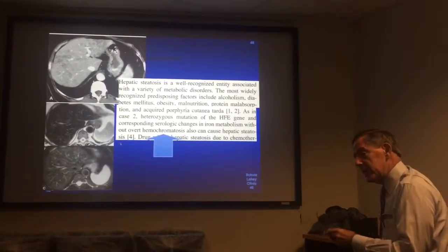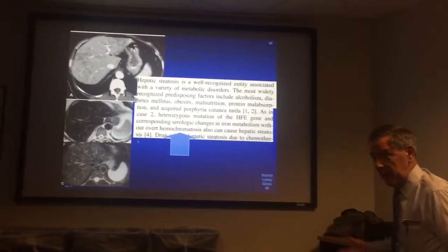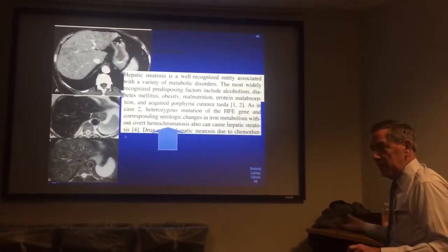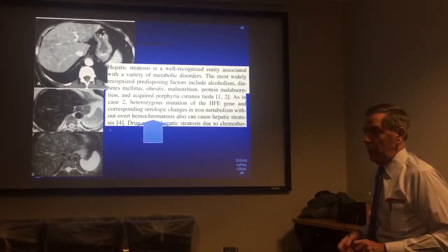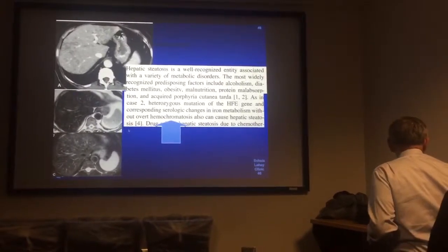Fair enough. And this is a case that some people would say as they're reading, I'll never see it. But I've seen 2 cases recently. The once in a lifetime cases, when you get to be 20 and 30, you'll see your 2nd, 3rd, and 4th ones. So you put them in your differential and expand it.